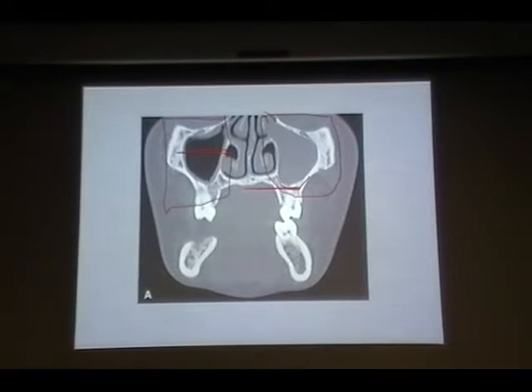So again, I'm just putting a slice here after looking through multiple slices. Then I was confirmed that it's not a tooth-related problem. You have to rule out. That's why you have to check the whole slice, whole volume, to confirm.